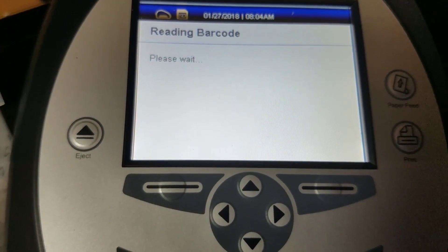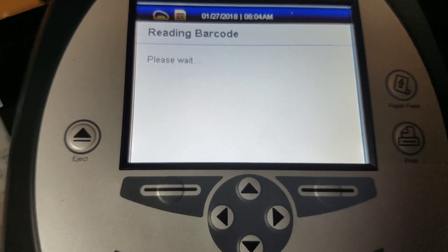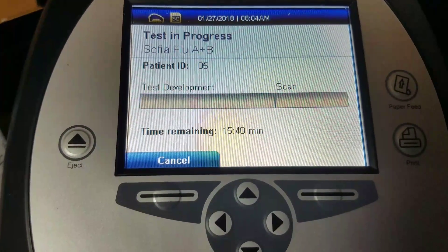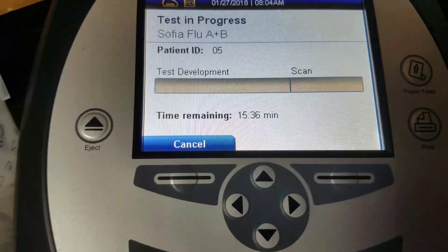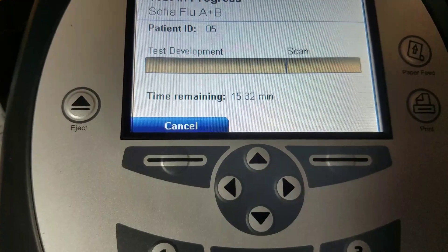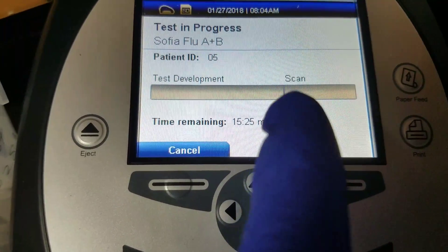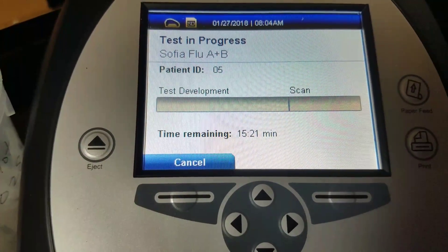It says please wait... test in progress: Sophia flu A and B — that's what we're testing for. Patient ID is number five because I'm testing our fifth specimen in test development. It has about 15 minutes and 30 seconds left. When it gets to about this line where it says 'scan,' that's when it starts actually reading the result.